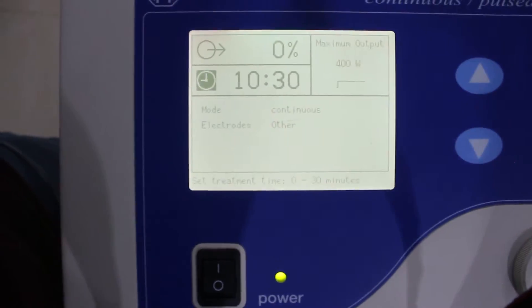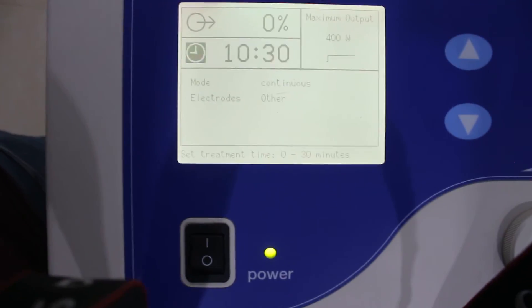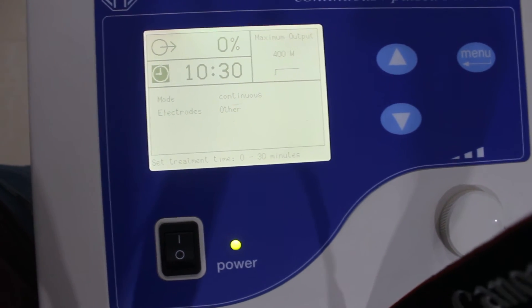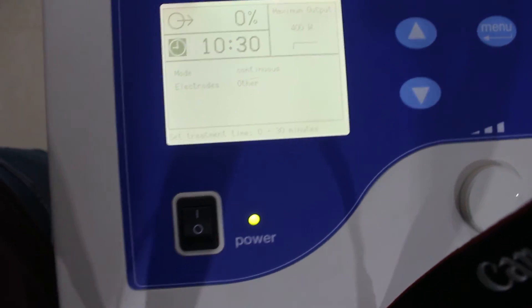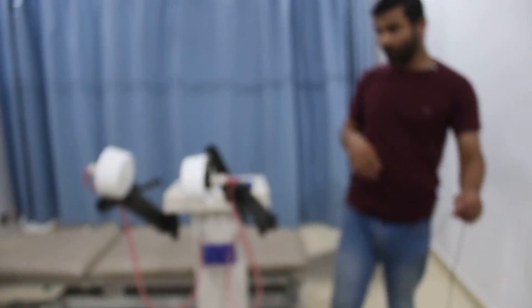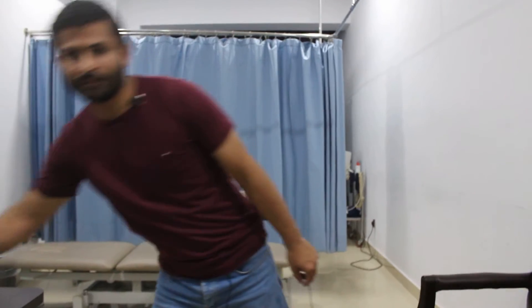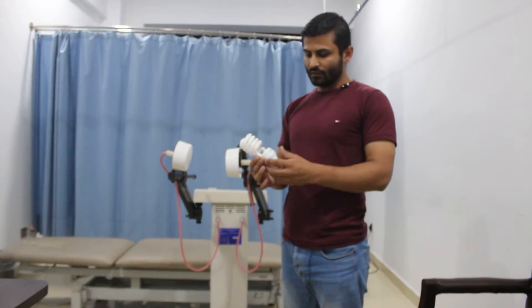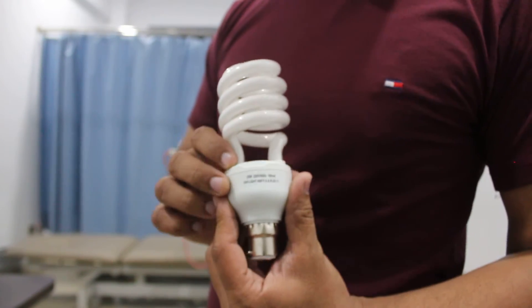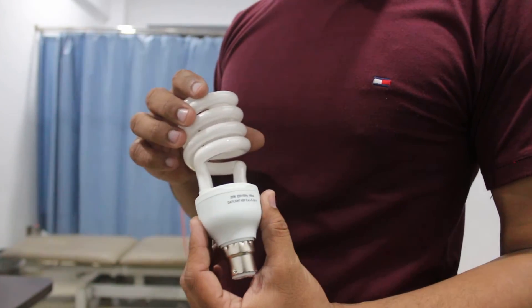If I turn on the output it will begin treatment. I'll show you how the electromagnetic field of this unit works with the help of an incandescent bulb. I'll ask the camera operator to move away to a safe distance of about three to four feet. This is the incandescent bulb — a normal AC incandescent bulb.